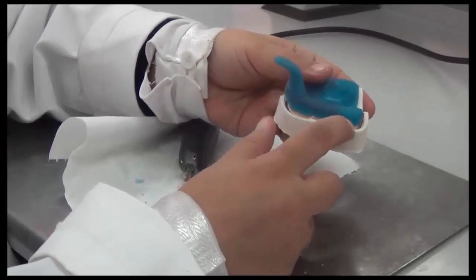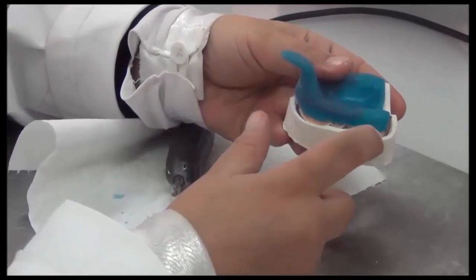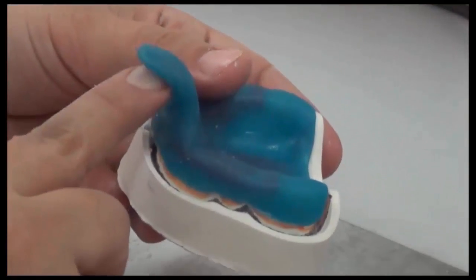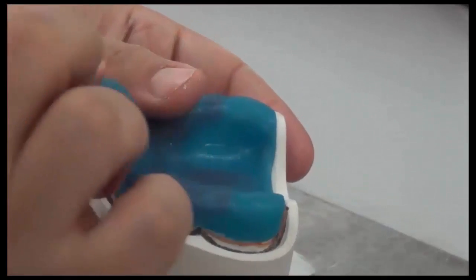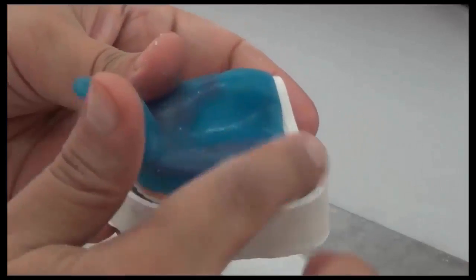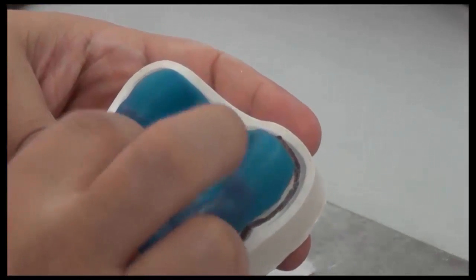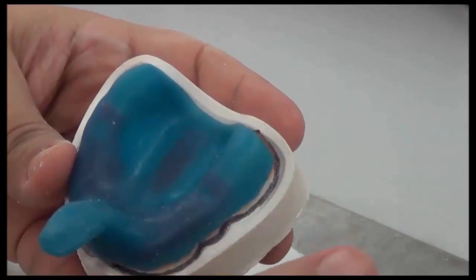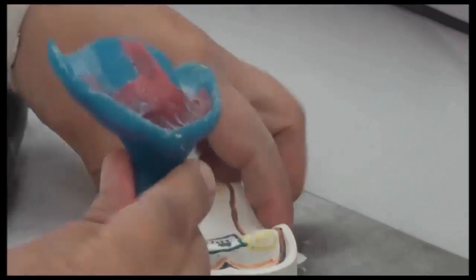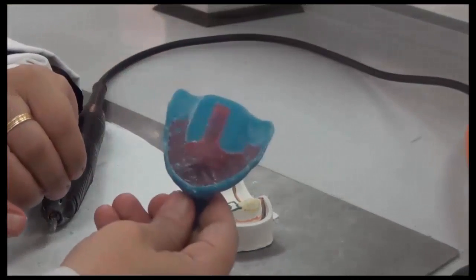For this purpose of training, I have just exposed a bit more for you to see the lines, that the tray is shorter than the sulcus line in this case. The handle is vertical in its first 2/3, then it goes to the side where I can get a grip. The surface is all smooth all around. The thickness of the light cure material is uniform all around. I have not overpressed it in any way. And this tray is ready for step number 2. It contains the partial relief embedded inside this tray. So this tray is ready.